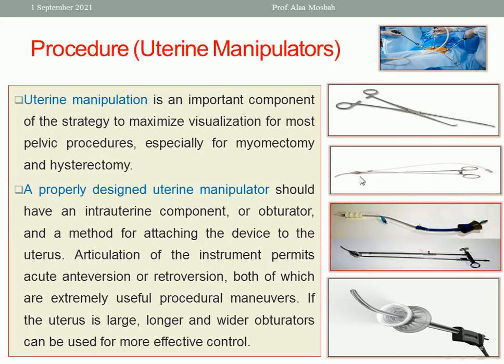Another one here is associated with the head of an olive cannula for insertion of a catheter for injection of methylene blue during operation for tubal patency. Another uterine manipulator here, one with a balloon to fix the manipulator inside the uterine cavity. When inflated inside, it will fix the manipulator.